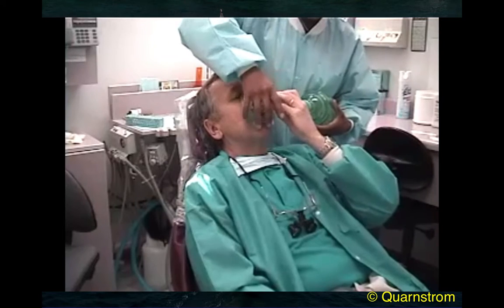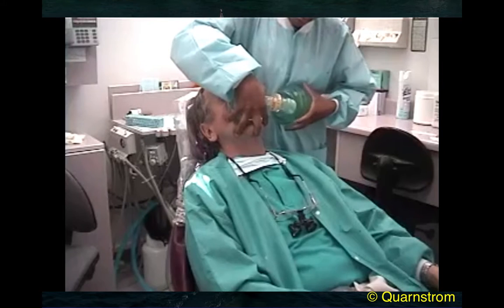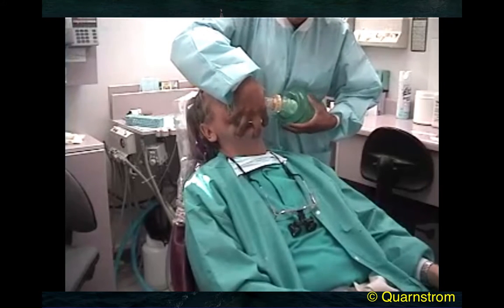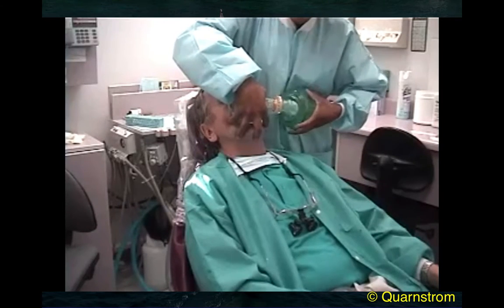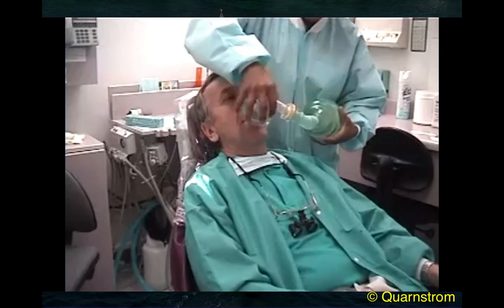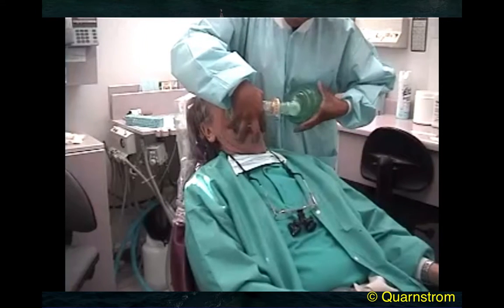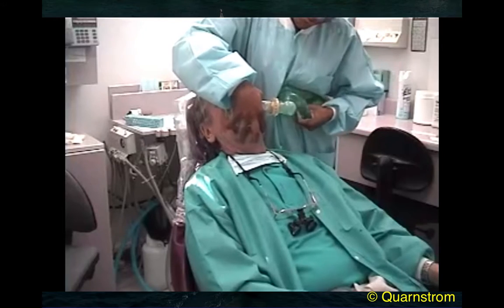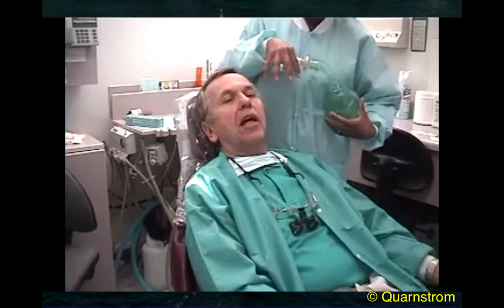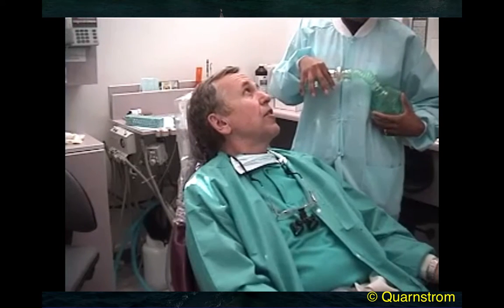Okay, go ahead. Keep going. Okay, thank you. So first of all, I occluded. You had a hard time squeezing. And then she gave me two breaths that were normal. And then the last two breaths I had created a leak. You notice the difference there.